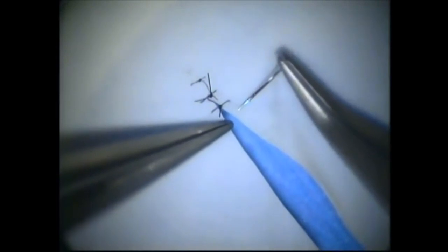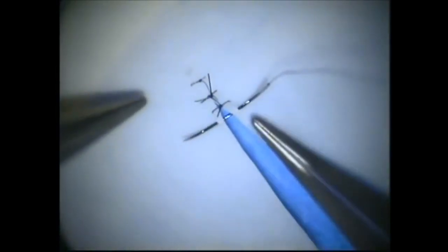We're going to zoom in to show the end of the latex glove, and we want the sutures to be equally spaced from one another. The first step is to place the left hand forceps — in this case a number two jeweler's forceps — underneath the edge of latex, spread the tips a little bit, and then coming back from the edge about three needle diameters, we pass the needle, which everts the skin edge quite nicely. Now we come straight across — not obliquely — and we use the forceps to stabilize the other side and pass the needle in this fashion.